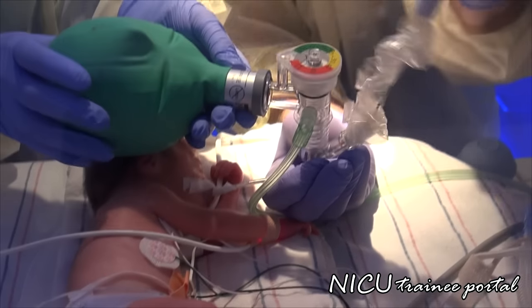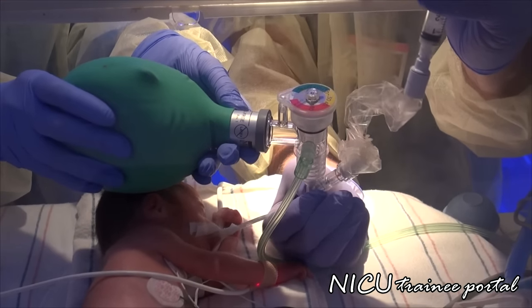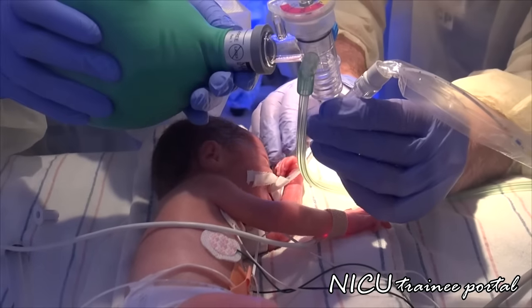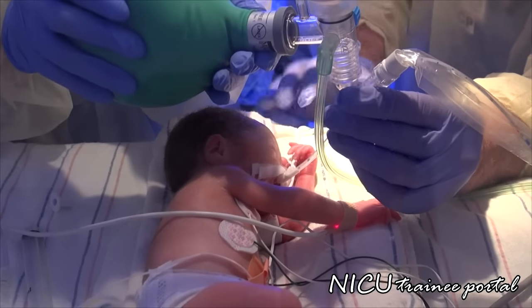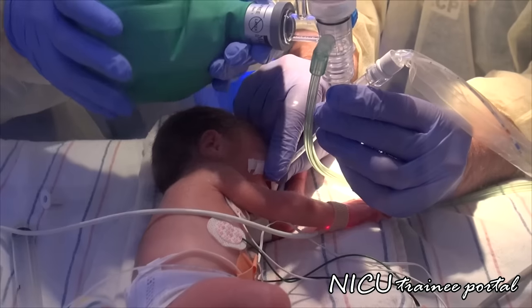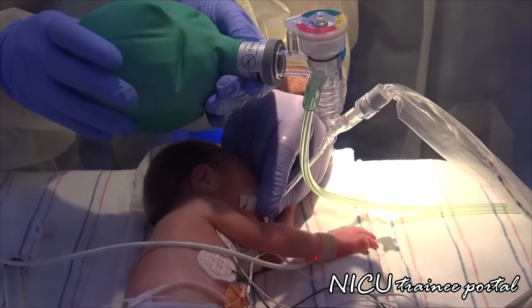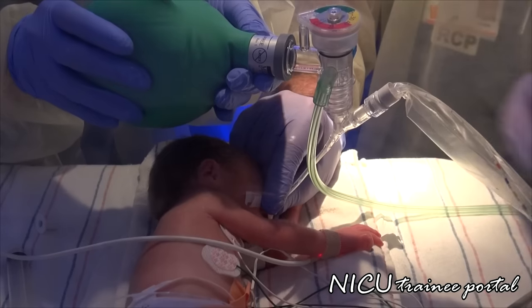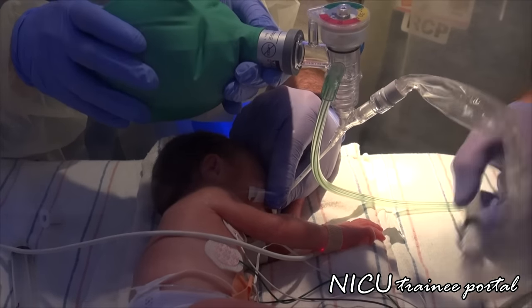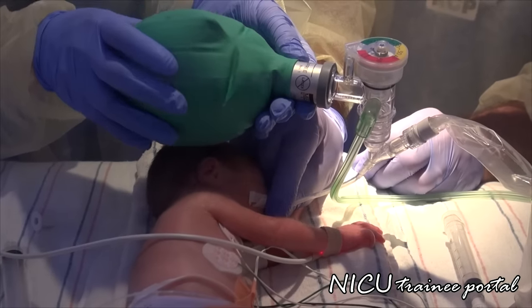The surfactant has been administered and the team observes a nice response. The provider confirms it looks good and states they will continue bagging for about a minute to ensure the surfactant distributes properly.